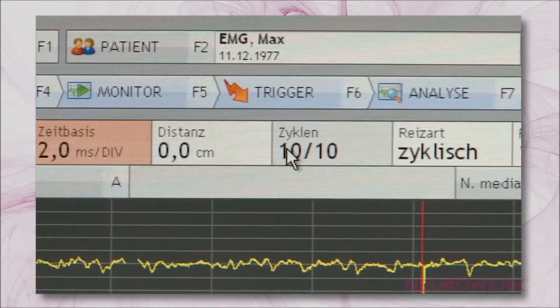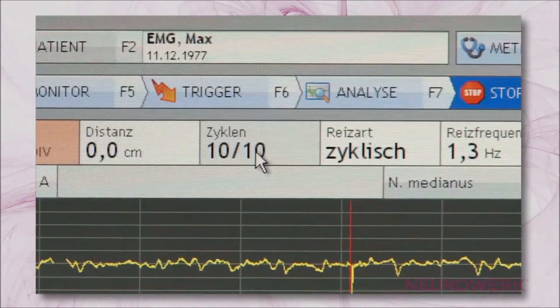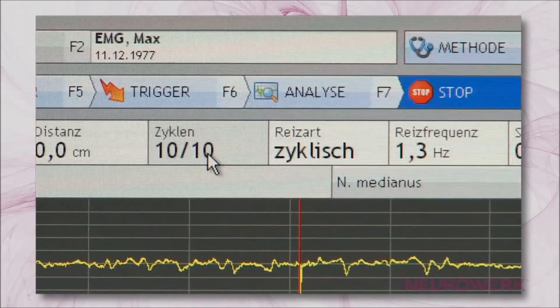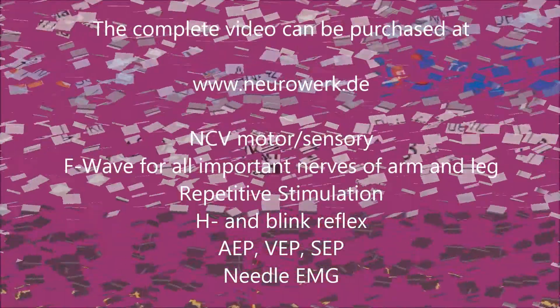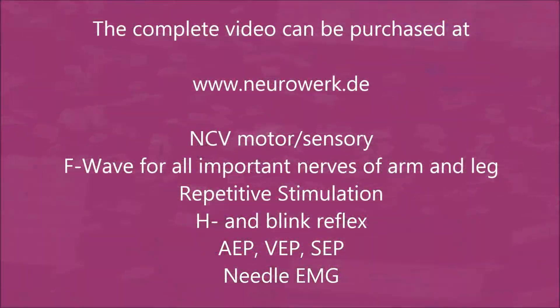Stimulus frequency: 1.3 Hz, 1.5 Hz. Stimulus duration settings vary depending on the signal type.